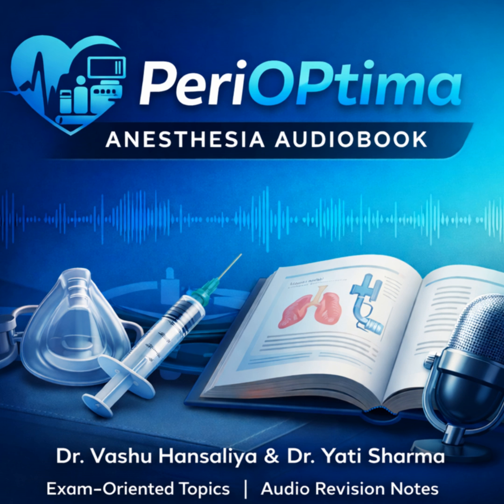And how does the second generation mitigate that specific gastric insufflation risk? It's the GDC again. While high pressures can still breach the seal, second-generation devices significantly reduce the consequences of that insufflation. If air does enter the stomach, the GDC allows for the passive release of that trapped air. This prevents excessive gastric distension, which not only impairs diaphragmatic movement, but also dramatically increases the risk of regurgitation. This safety margin is precisely why they are superior for PPV.